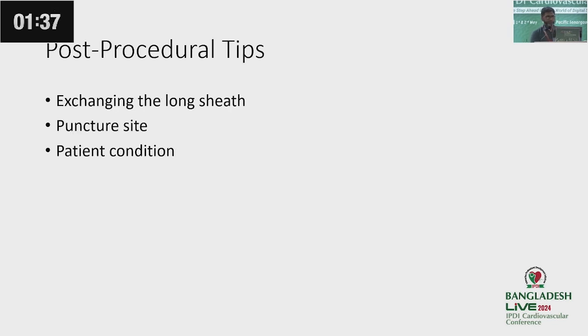Post-procedural tips. In case of a remote lesion, if we are using a long sheath, change it to a short sheath. Check the puncture site and patient condition. If the procedure is too long, the patient may feel discomfort. There may also be a chance of failure if we give too much fluid to the patient.